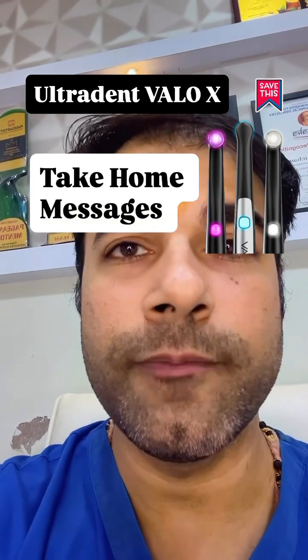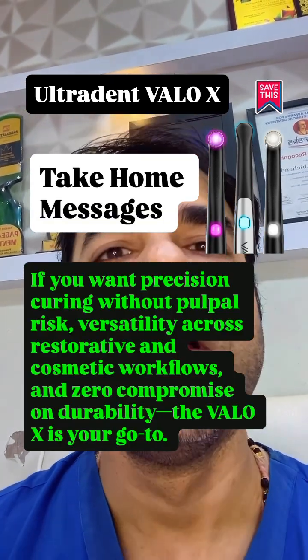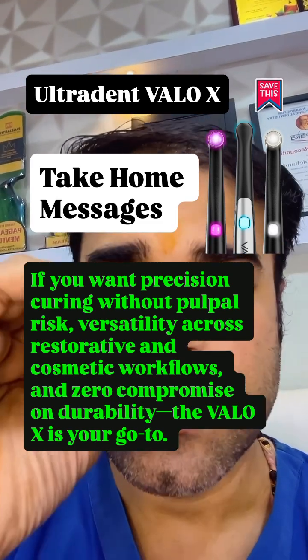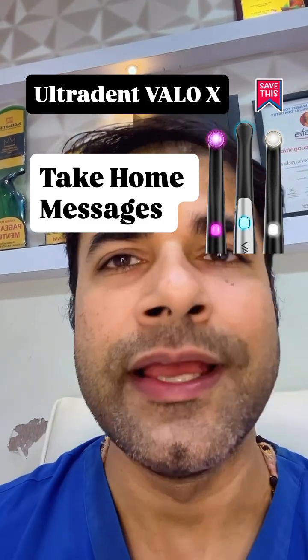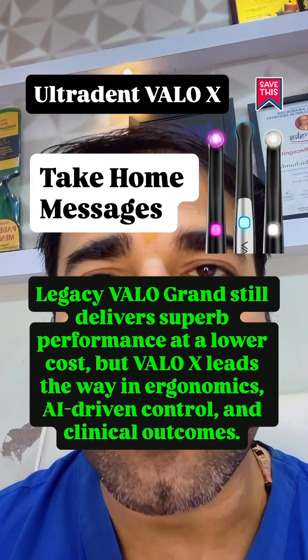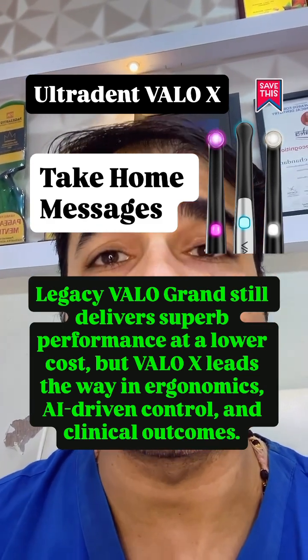Take-home message: if you want precision curing without pulpal risk, versatility across restorations and cosmetic workflows, and zero compromise on durability, Velo X should be your go-to option. The legacy Velo Grand still delivers superb performance at a lower cost, but Velo X leads the way in ergonomics, AI-driven controls, and clinical outcomes. Stay tuned for the next part — don't forget to save it, share it, and take care.